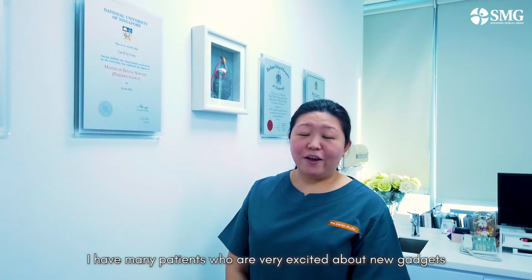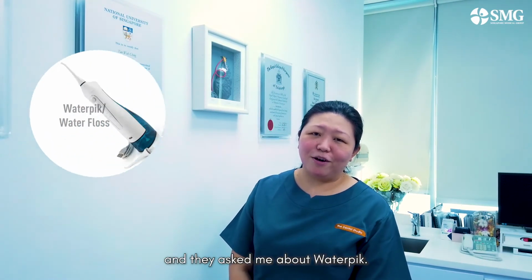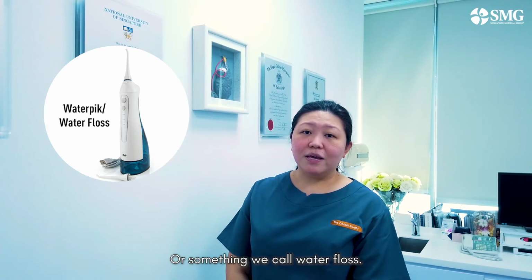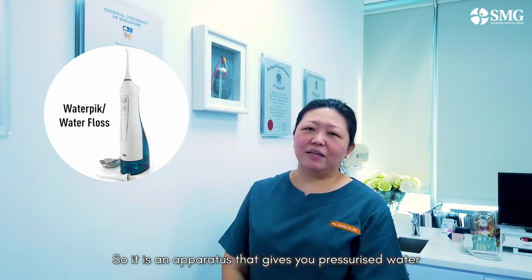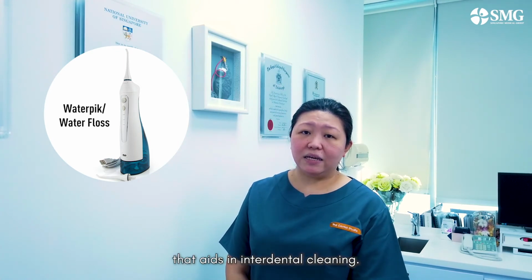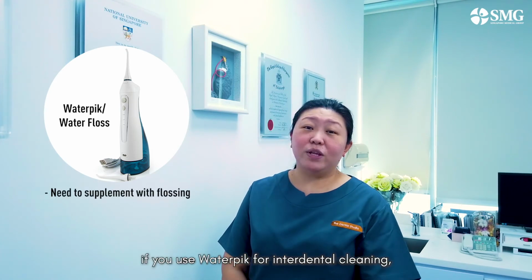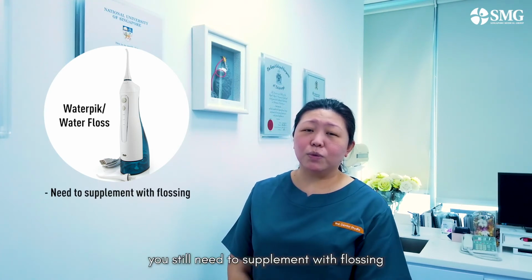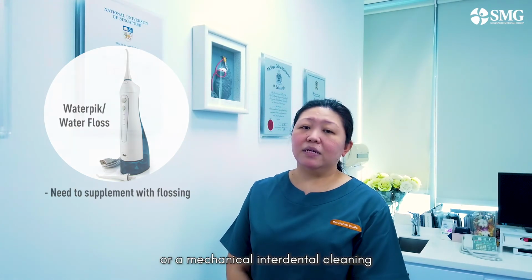I have many patients who are very excited about new gadgets and they ask me about the water pick, or something we call water floss. It is actually an apparatus that gives you pressurized water that aids in interdental cleaning. However, I usually tell my patients that when you use a water pick for interdental cleaning, you still need to supplement with flossing or mechanical interdental cleaning.